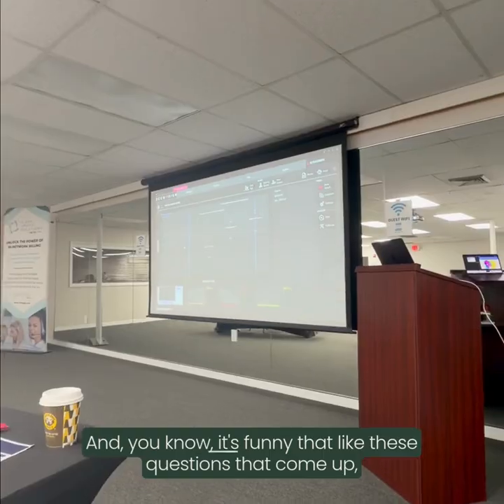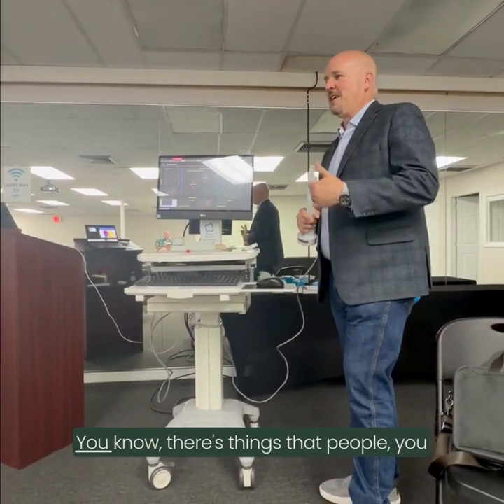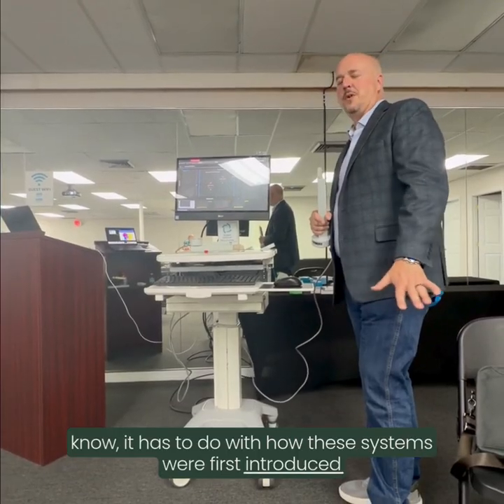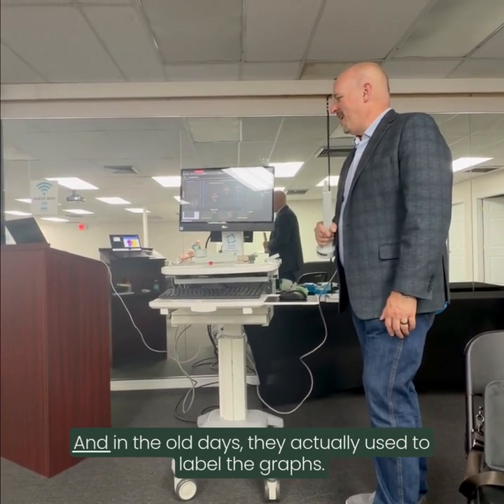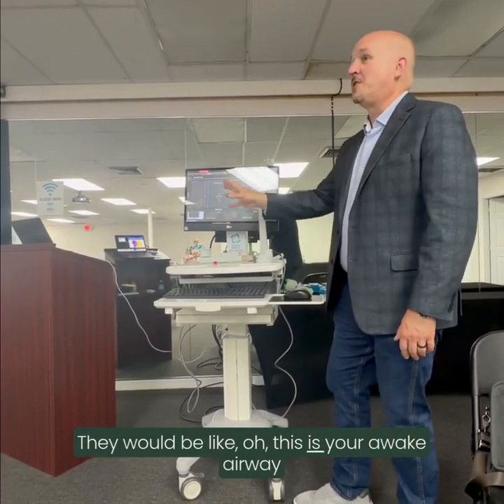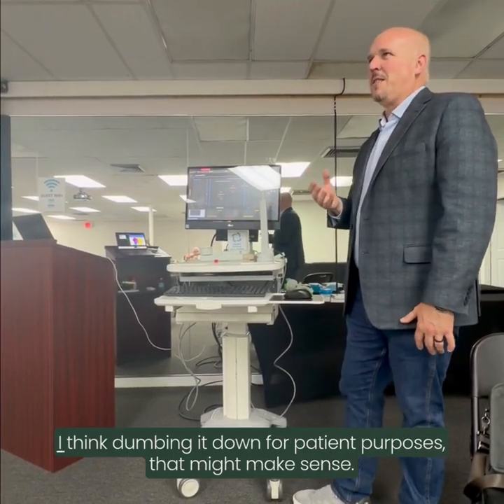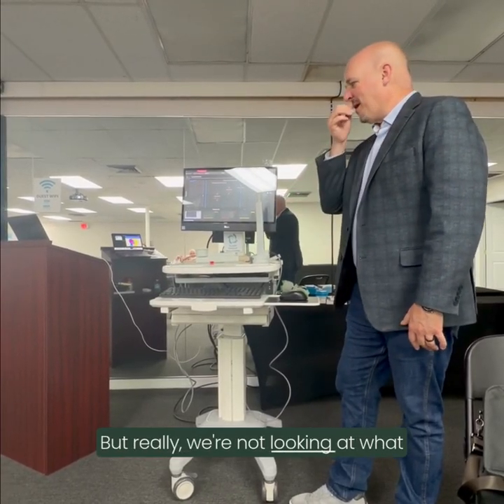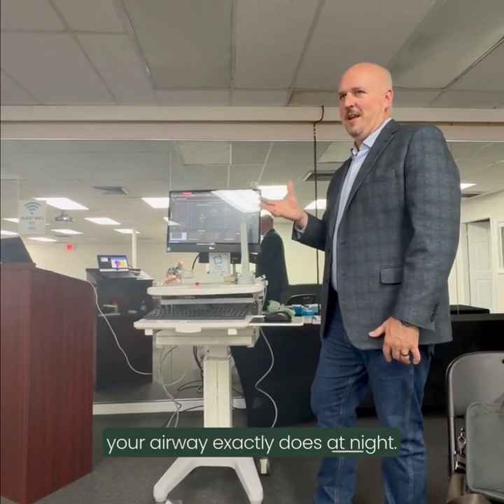It's funny that these questions that come up are legacy. It has to do with how these systems were first introduced into dentistry and how they were sold and how they were marketed. In the old days, they actually used to label the graphs. They would say, oh, this is your awake airway and this is your asleep airway. It's not necessarily true. I think dumbing it down for patient purposes might make sense. But really, we're not looking at what your airway exactly does at night.